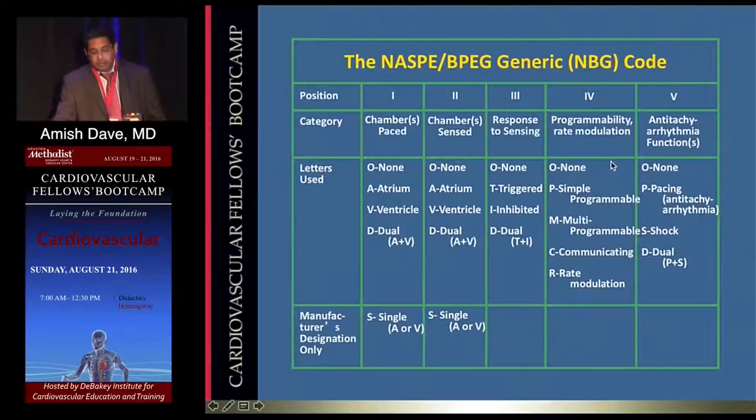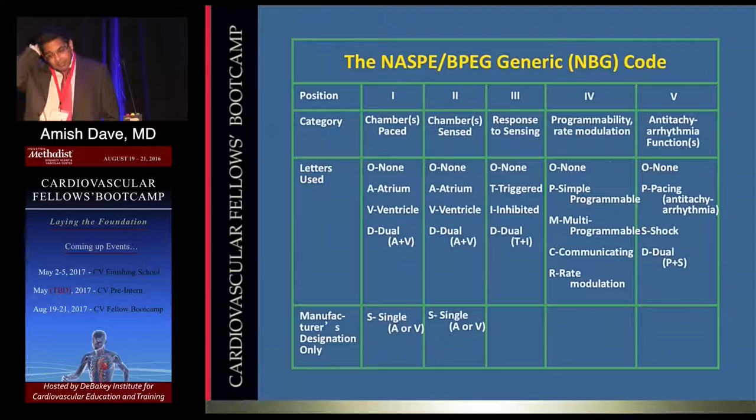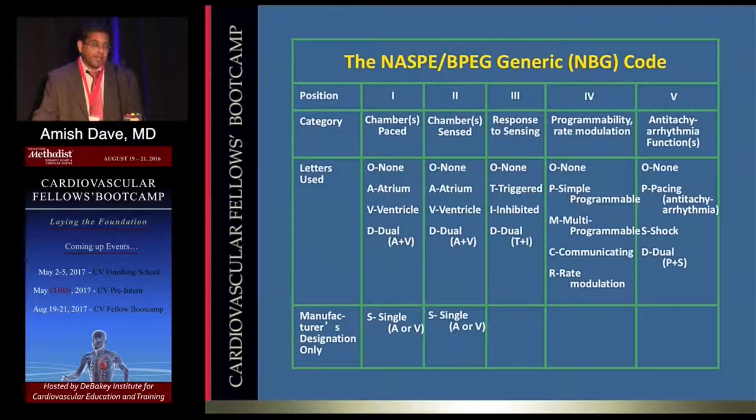Okay, so the last thing I'm going to talk about, this last slide, is really the codes that you hear about for pacemakers. This is oftentimes a source of confusion. There's three-letter acronyms that really get bothersome at times, but basically the ones you're going to see are DDD, VVI, or VOO, or DOO. Anything that ends in O and O means you're asynchronous. You only have to pay attention to the first three letters.